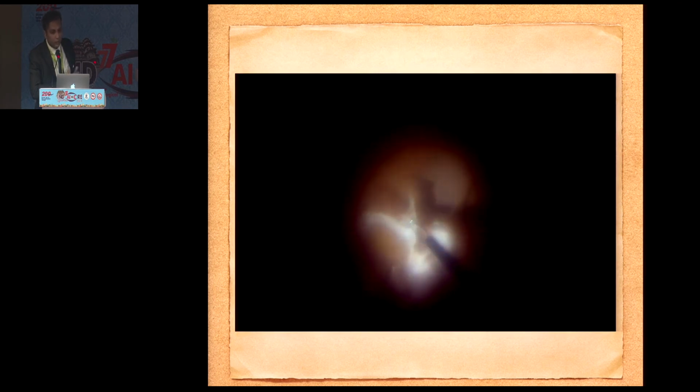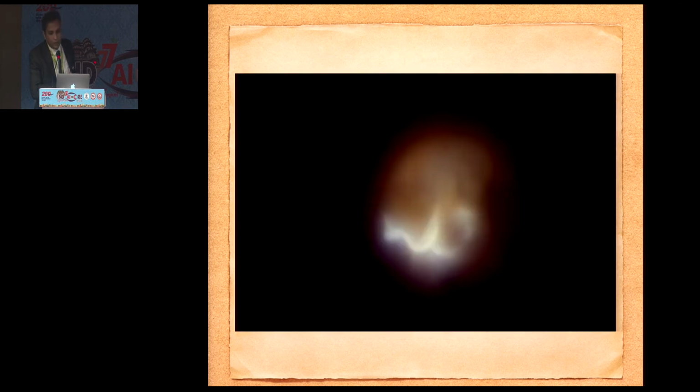The only thing you have to remember is that the surgery should be done by an expert surgeon, because it should not mess up the second surgery. It should be quick, it should be clean, and the pupil should be well dilated, the IOL should be well centered. As you can see, the dissection can be performed beautifully under the IOL, which would not have been possible if the lens had been cataractous.